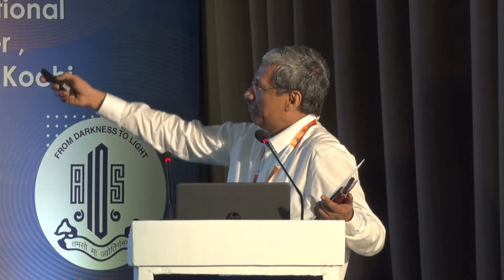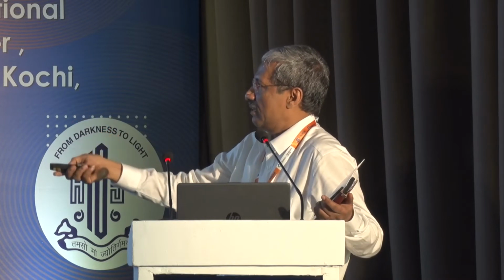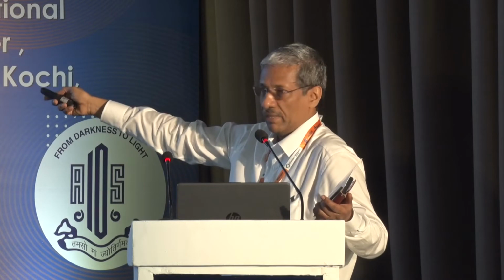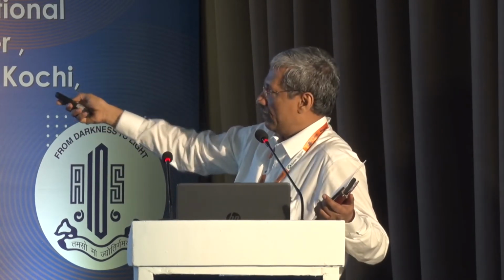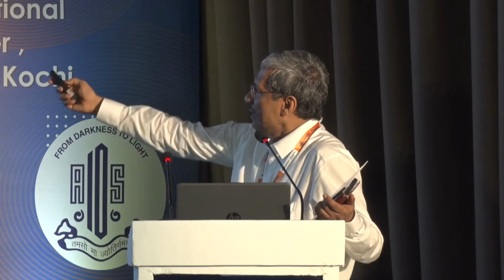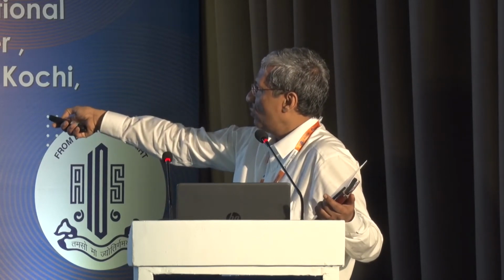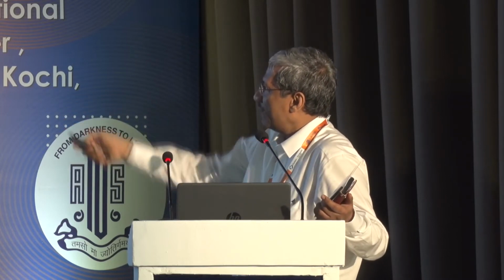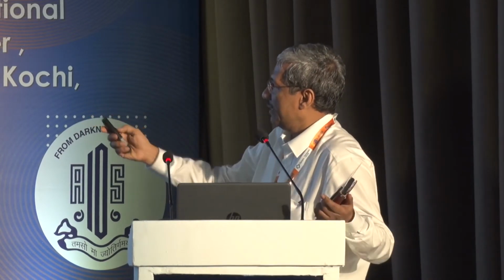So it puts the thickness map on the back of the topo map, and then you get the axial power map. That's it. And you get a derived map similar to this, and this represents approximately the central 4 mm of the cornea. Now, if you look to the right, we all know this as a huge oblique cylinder with a steepening and an approximate crab's claw kind of appearance. So we know this is a pellucid marginal degeneration in the making.